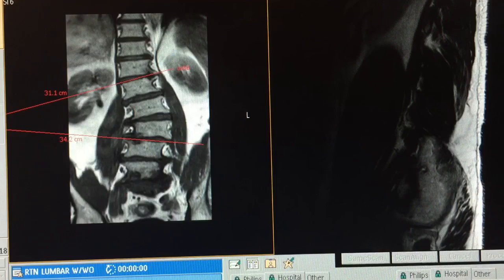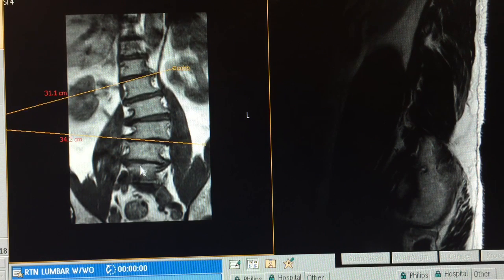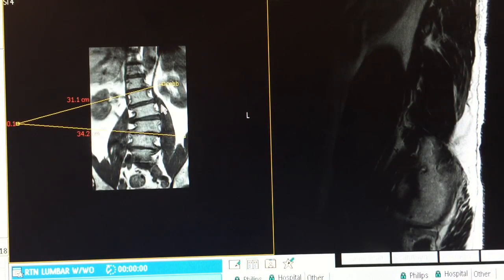Most likely you'll only be using the copy all option. That'll conclude our Cobb angle measuring procedure — hopefully that helps clarify some things. Thank you.